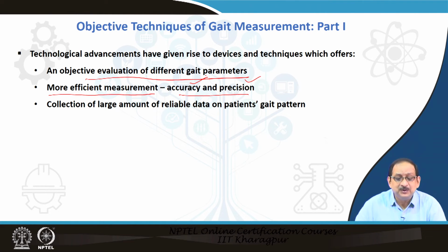They give rise to collection of a large amount of reliable data on patients' gait pattern. We have a large amount of data at our disposal for different purposes like diagnosis and evaluation of gait abnormalities.